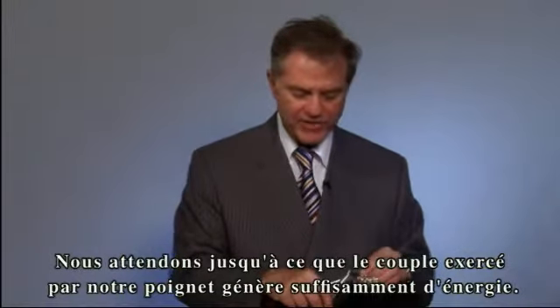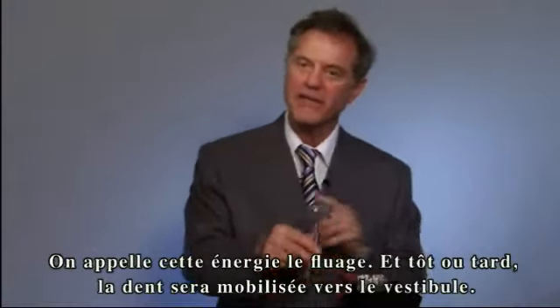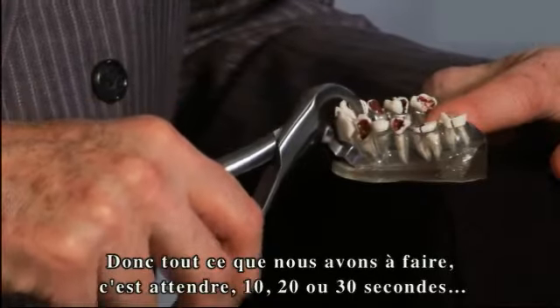That torque will create energy. In every extraction we do, the wrist creates energy, which is called creep, and the tooth eventually will move buccally. So all we're doing right now is waiting — 10 seconds, 20 seconds, 30 seconds — and the tooth rotates forward.